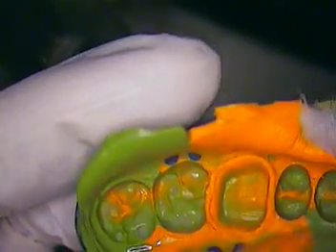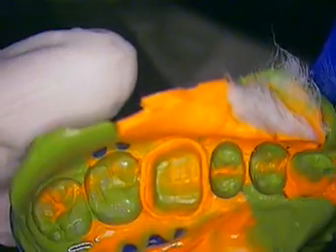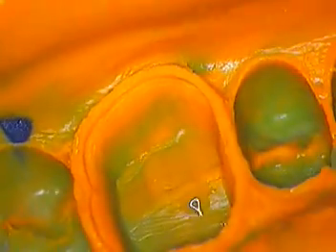Hello again. Once again, we're back with Oleg's case, and I just wanted to show you now the impression. This is Dr. Jerry Cuomo. Again, the detail of the impression. Notice the flash, the beautiful flash that you're getting all the way around. You can see that margin crystal clear now.